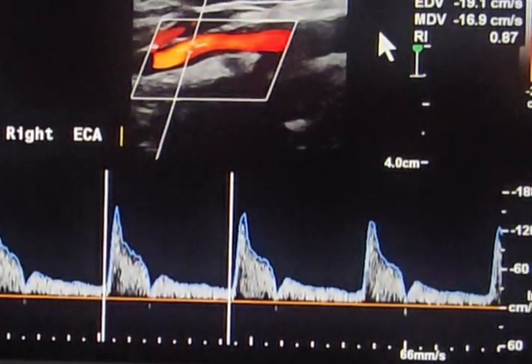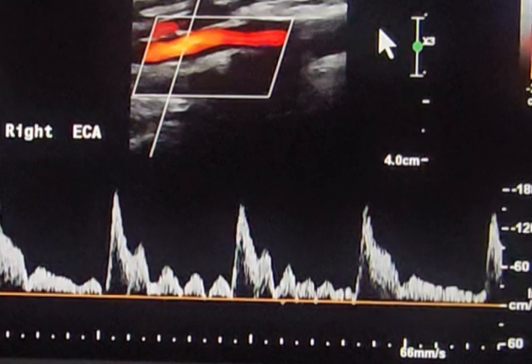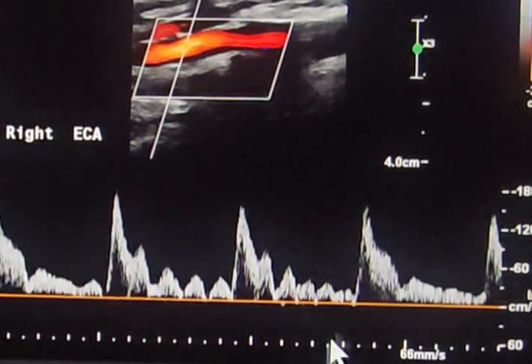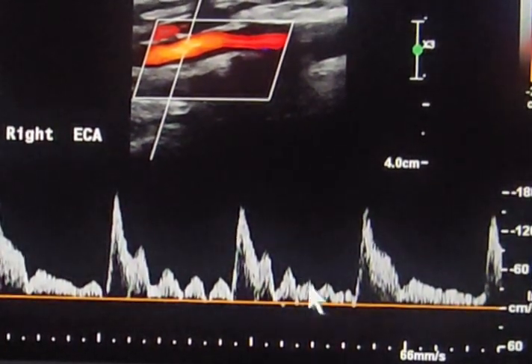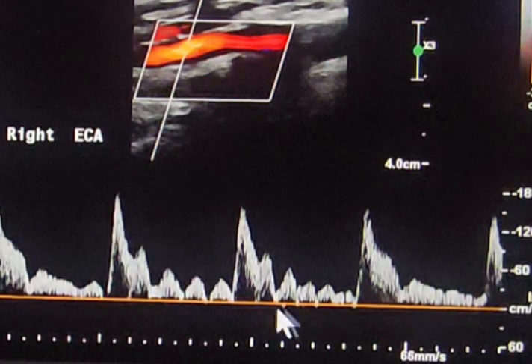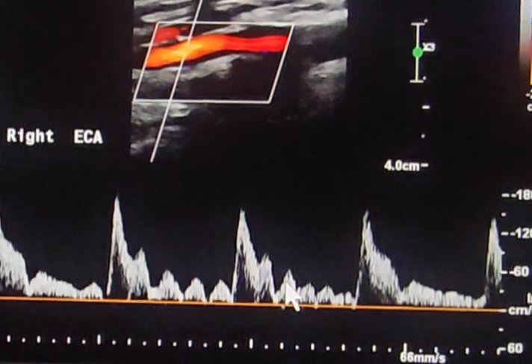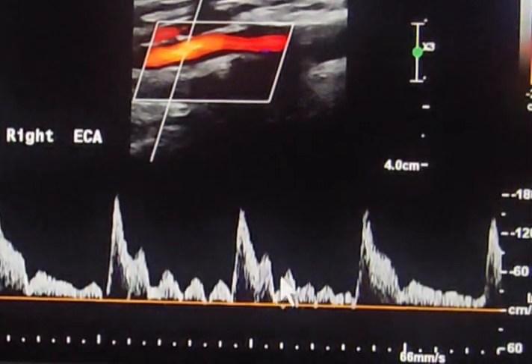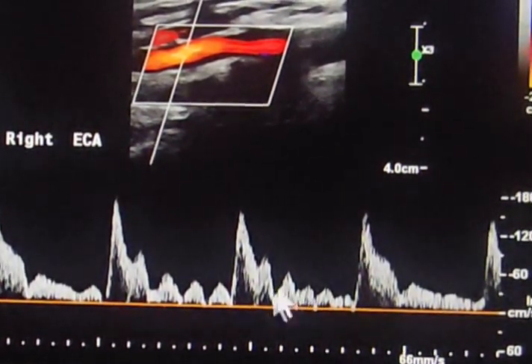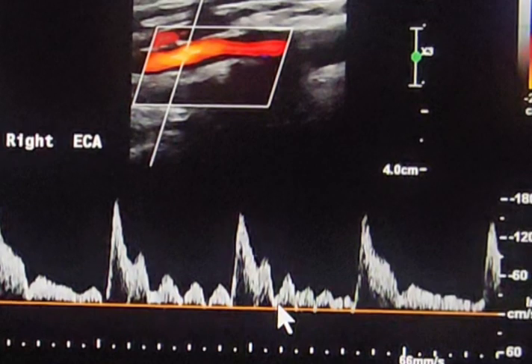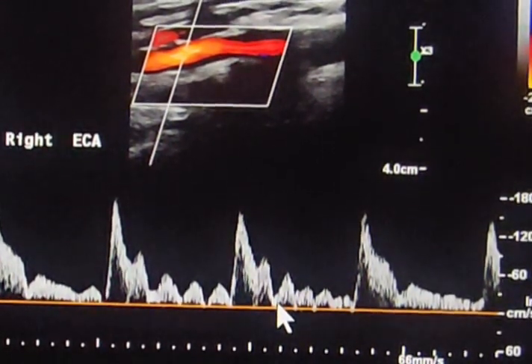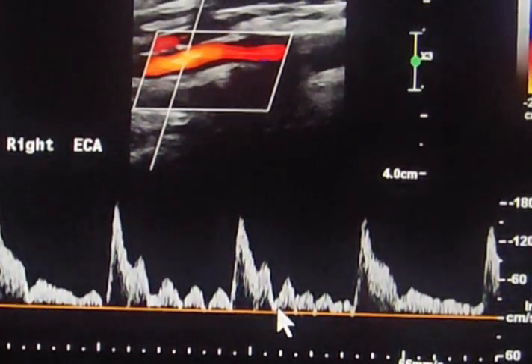We will scan the external carotid artery, and here we use the temporal tapping maneuver. As we tap over the temporal artery, we can see the change in the waveform, and this will help us distinguish between the ECA and the ICA.